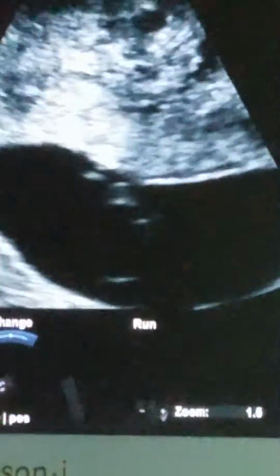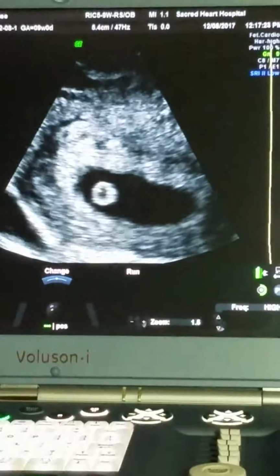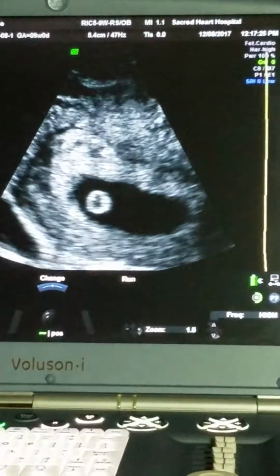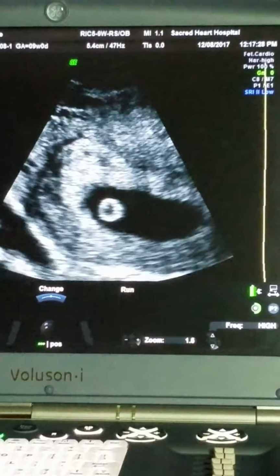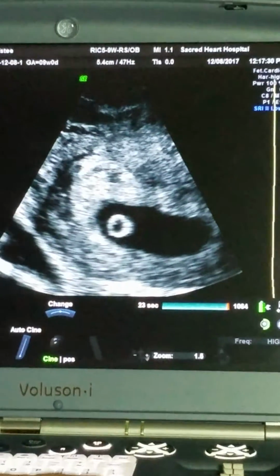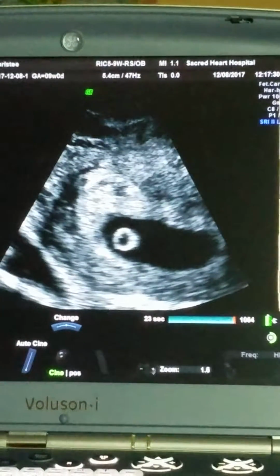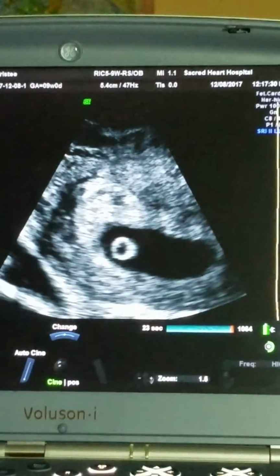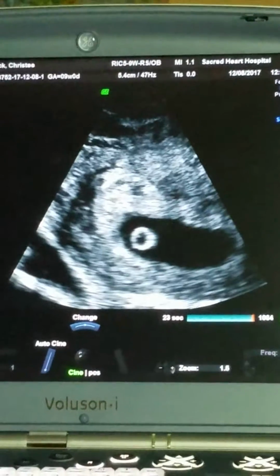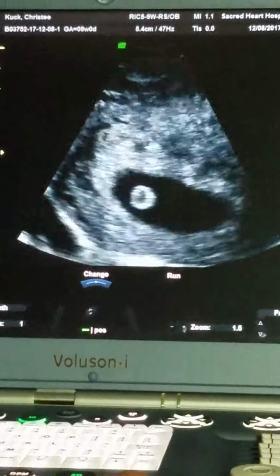pushes it against the big sac. And then the third sac we're supposed to see is the yolk sac. That is the yolk sac. Okay. When the yolk sac is normal size, it goes along with normal chromosomes, and that looks all good, you know, in the sense of like it looks not too big. We don't want them big. So the 3 sac sign, which is a normal size yolk sac, a normal amnion, and a normal chorion, you have all those. So that looks perfect.